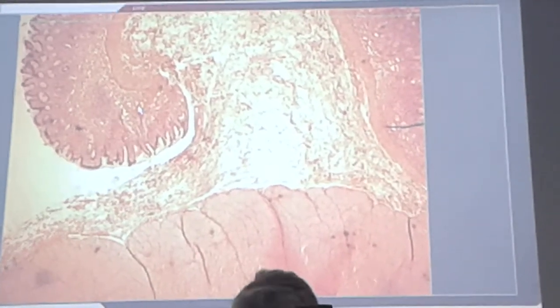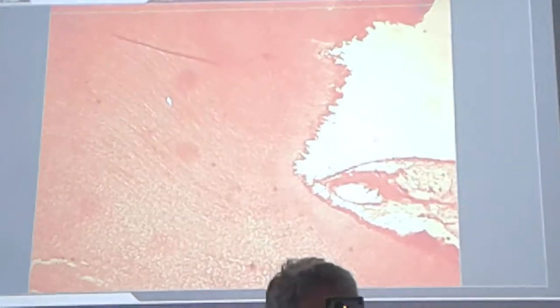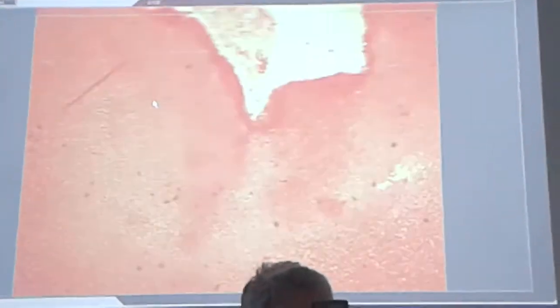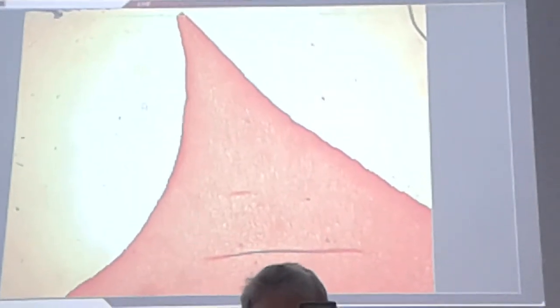Our last section is about the tooth. Just to remind you that the tooth itself is formed of the hardest calcified material present in our mouth. It serves for the breakdown of food material into pieces and getting ready for the digestive processes.